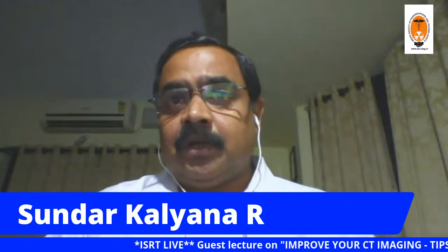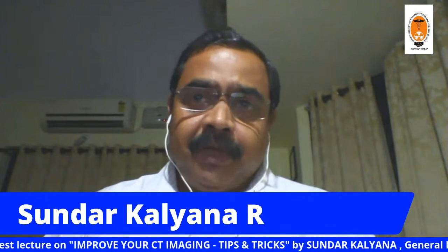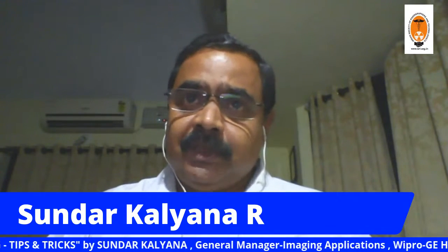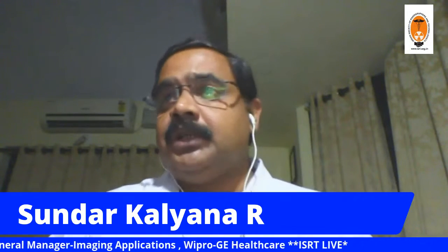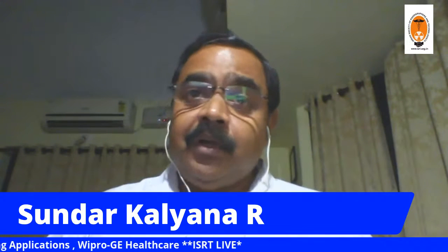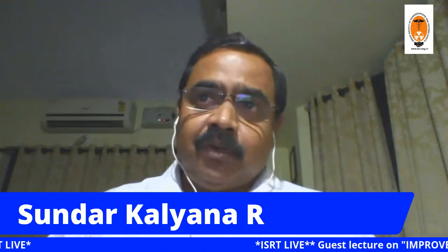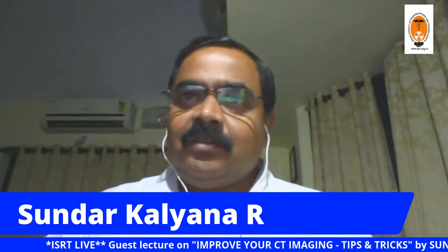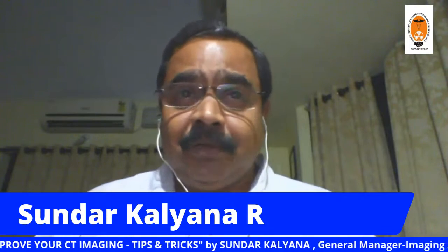First of all, when you say a pediatric cardiac angio, one question I would ask is whether you are going to do a gated run or non-gated run? What is the purpose of it? Mostly in pediatrics, you don't need a gated run as you are interested to see the great vessels. So it's better to go for a non-gated run to see the great vessels. And compared to a gated scan, a non-gated scan will give enormously low dose. Okay. So first of all, select whether you need to go for a gated or a non-gated run. Because we are not going to identify coronary artery disease except in one of your very limited conditions in pediatric cardiac studies.